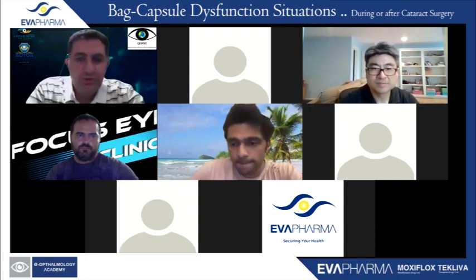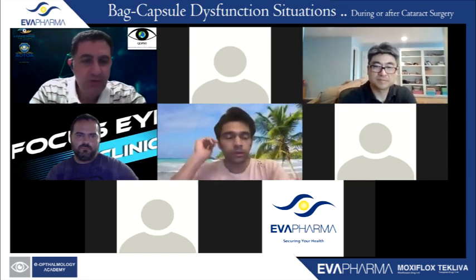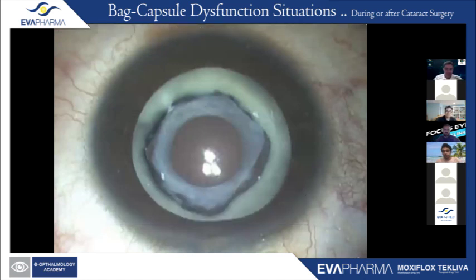So you grab your capsule when you do this. When you do this from the start, which point of your... As soon as you start the lensectomy and you get a good grab of that bag, just go and grab any part of the capsule, and make sure that you don't leave that part of it. And you can then bimanually hold the other one when you're using your left hand and swivel bit. You have to be a little bit ambidextrous in these cases.